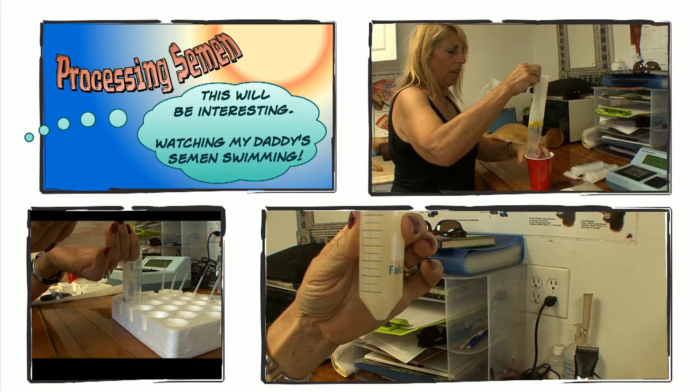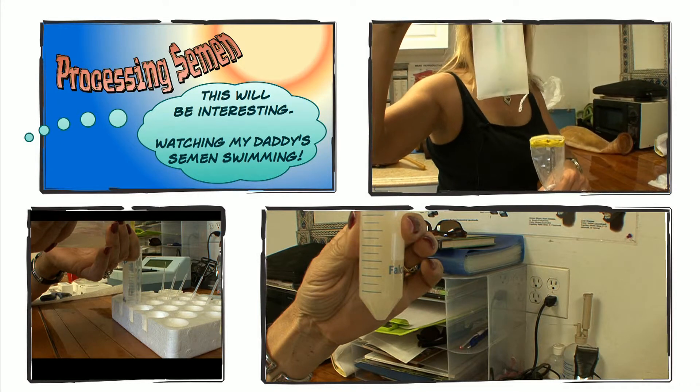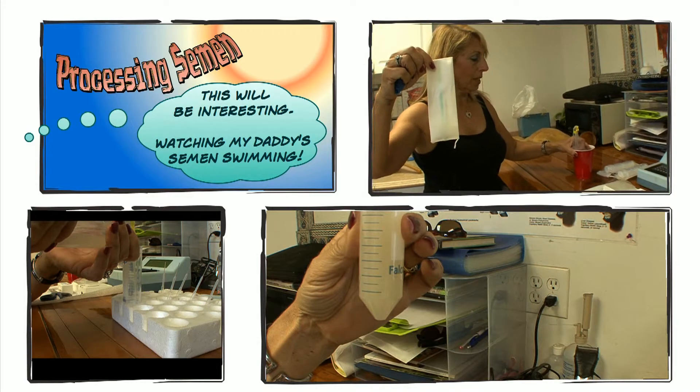This horse is very clean, and what is left in here — this is kind of full — has the gel in it. Remember Snickers, the gel is not good. We've removed it so it doesn't hurt the semen.